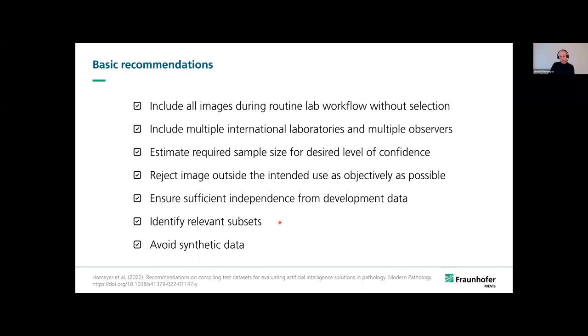Identifying subsets is also not that easy. Usually this has to be done on the basis of world knowledge, but as an aid, it's also possible to use unsupervised clustering approaches to identify potential subsets automatically. And this was a very controversial recommendation that we reached in the paper, and that is that for test data sets, you should avoid using synthetic data.